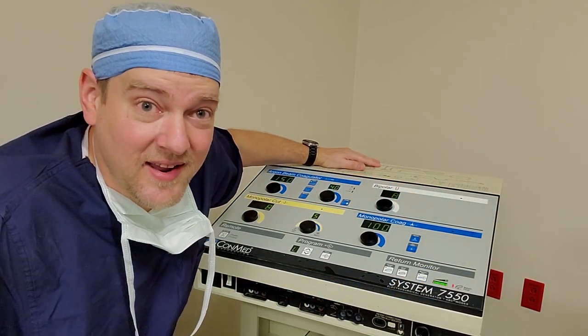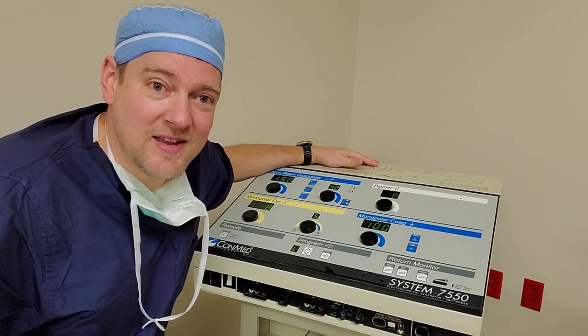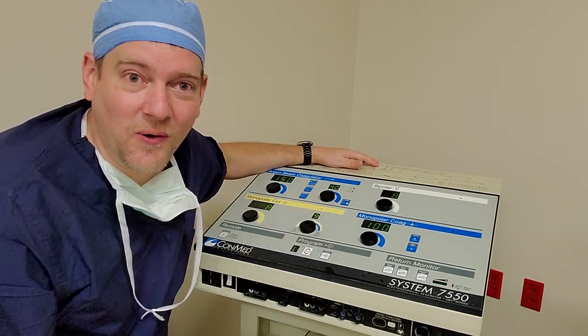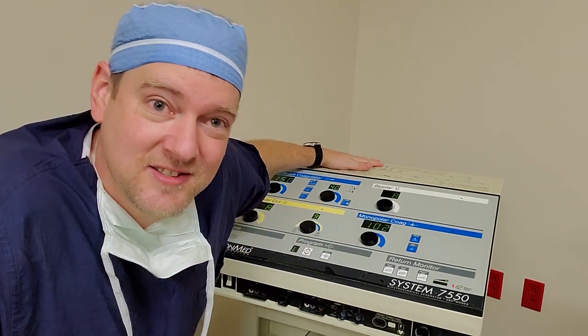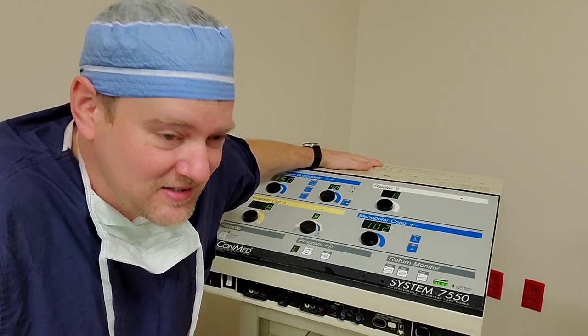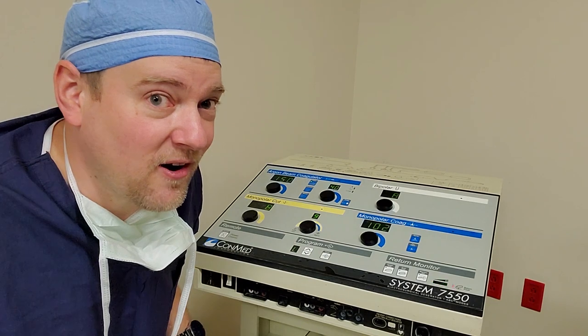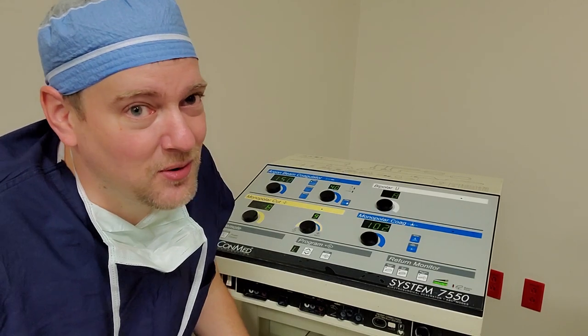Good morning. It's 3 a.m. and I couldn't sleep. I wanted to come in and show you guys my 1960s rocket launch console. Not really, guys — it's just an ESU, but it's an ESU with a couple secrets. With the addition of a special handpiece and a tank of argon, this guy here turns into a fire-breathing, blood-coagulating beast. So let's check it out.